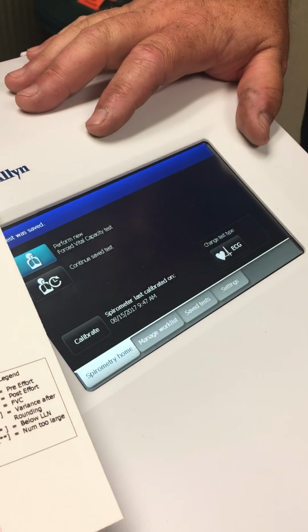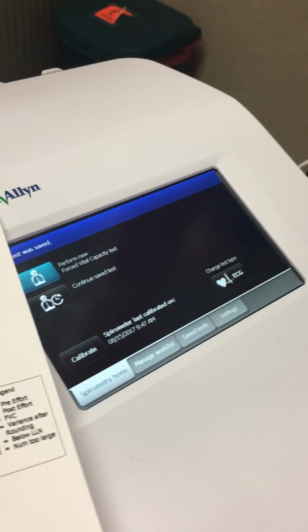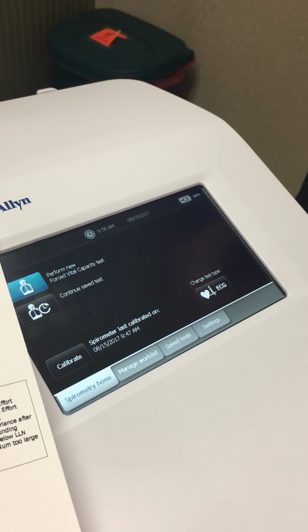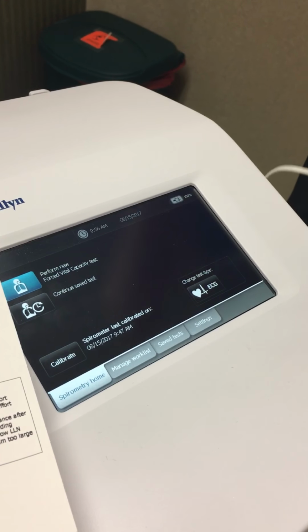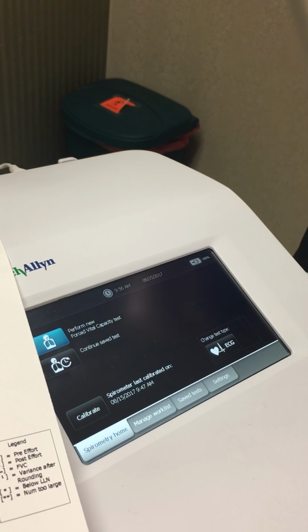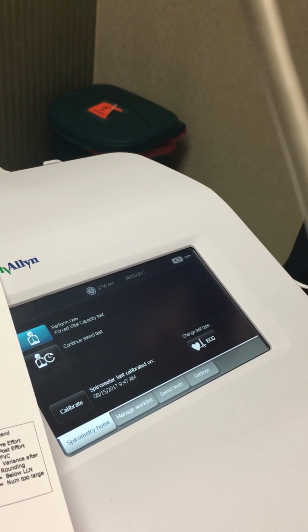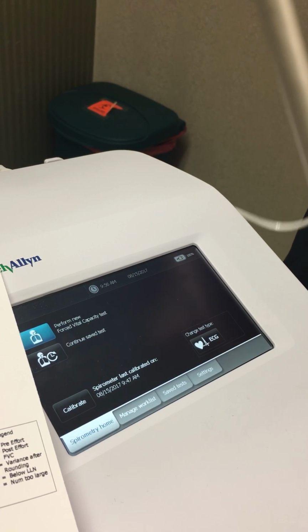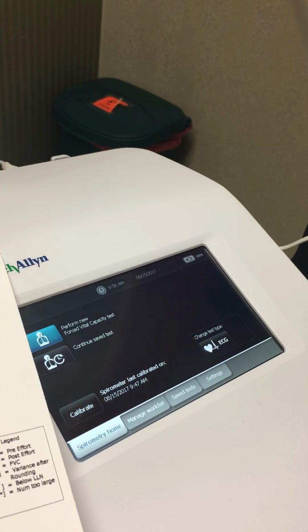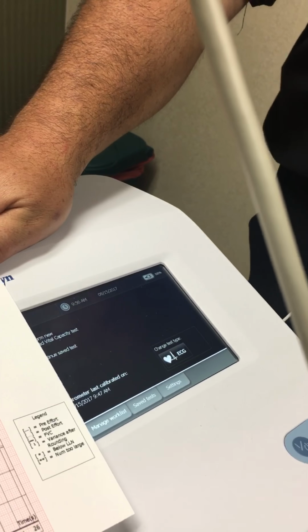Now it's saved. Now the reason I did that is if Heidi's testing me, what's your name? Nicole. Nicole. So you're testing me, I'm done. Now you're going to give me an inhaler. You're going to wait 10, 12 minutes. Nicole needs to go do an EKG on Anthony. She takes the machine. Now she's done with Anthony. She brings it back to you. You get ready to do my post-test. So now you did my pre-test here. Now you treated me with an inhaler. Now you're going to test to see how well that inhaler worked.